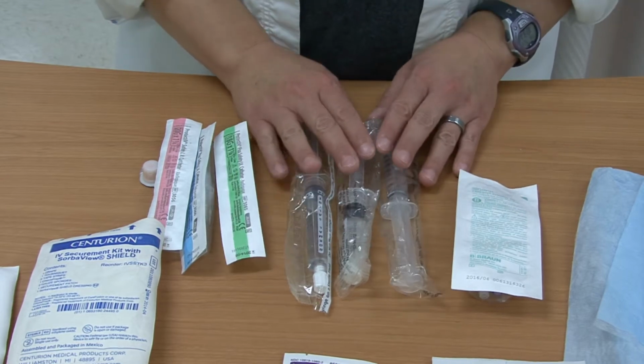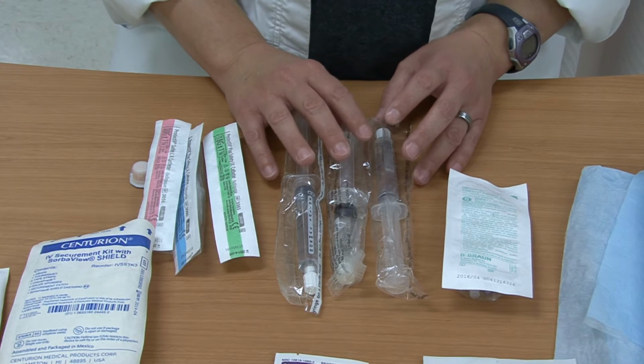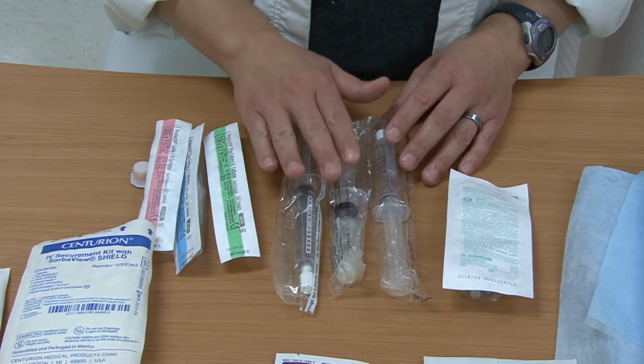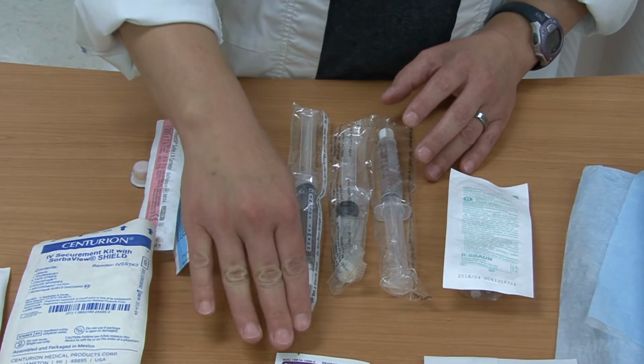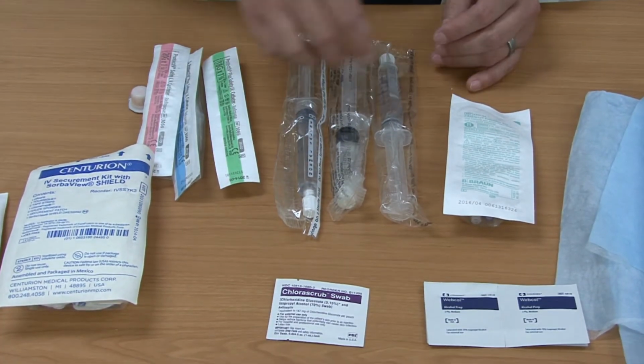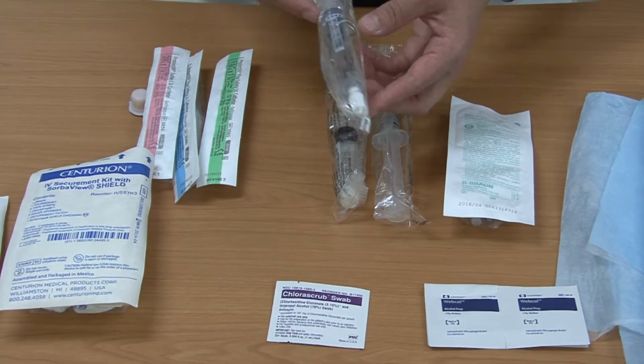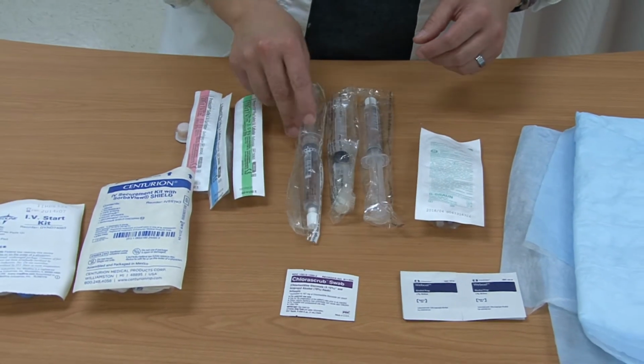You'd certainly need saline flushes because anytime you flush either a saline lock or the IV, you need to use a new saline flush, and you need to clean it with whatever the appropriate agent is in between. With any of these packages, you always check to see that they are clean, dry, and intact, and check the expiration date on any of the equipment.